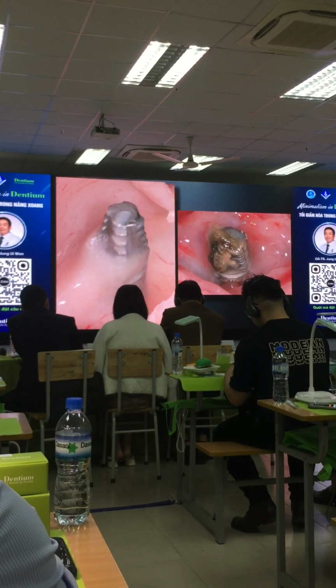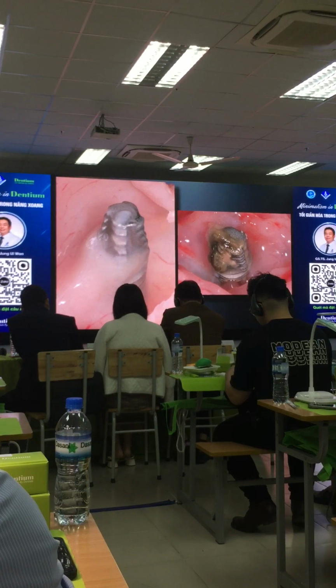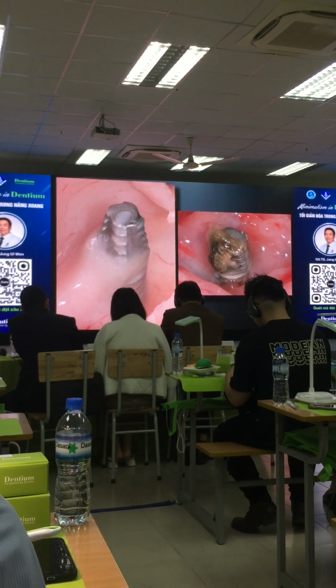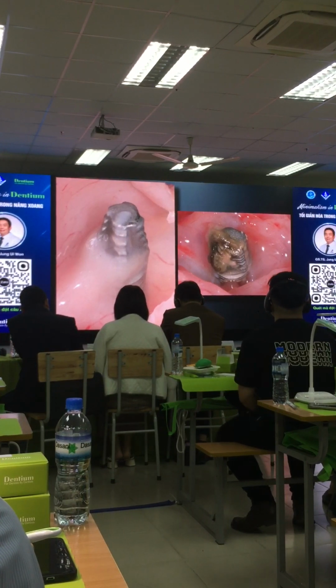The crestal approach requires simultaneous placement of an implant protruding into the sinus cavity to tent the sinus membrane and create an adequate space for blood clot formation. However, it is not always possible and may not result in a sufficient amount of new bone formation.